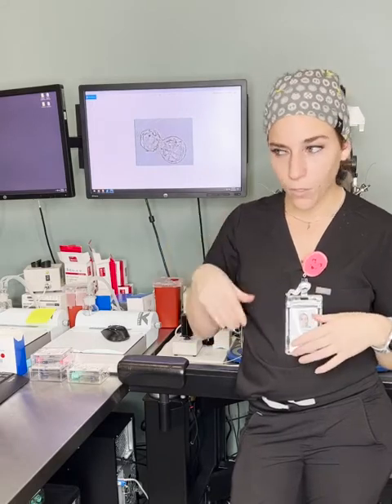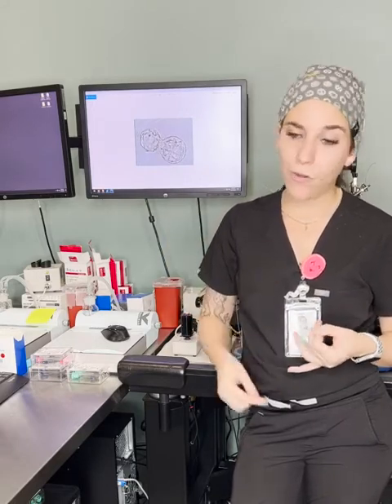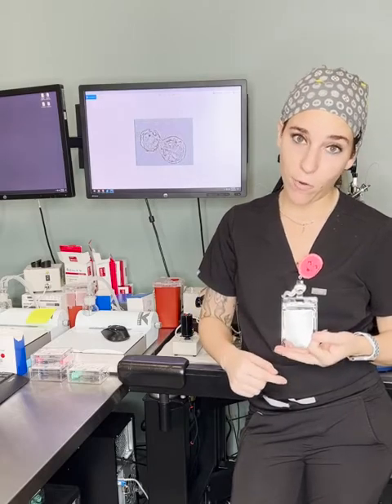I hope this sheds light on how much attention to detail all of us spend, because here at AFS we take pre-freeze photos, pre-biopsy photos, and post-biopsy and post-freeze photos. I like to look back. When Dr. Wong and I are going over an FET and trying to decide which embryo to thaw, I go back to those pre-freeze photos. Obviously, I want to see the photos of how the embryo looked after biopsy. Yes, it's going to be collapsed, but that embryo is going to re-expand most of the time and look just as nice as it did before. So I like referring to those photos, and that helps us make a decision. I really do think it makes such a huge difference to be able to go back and look at those, because grading is just so subjective.